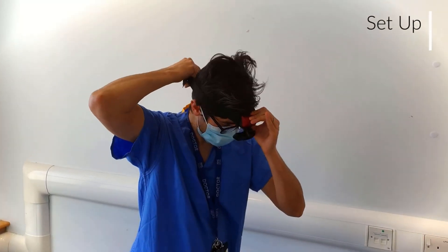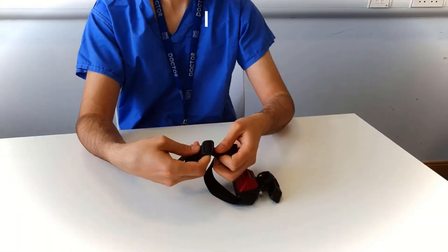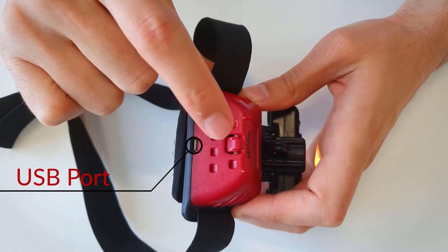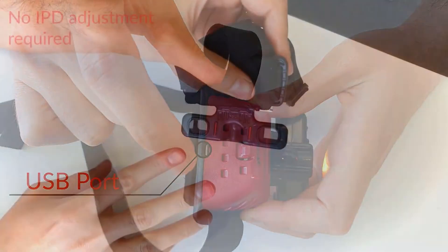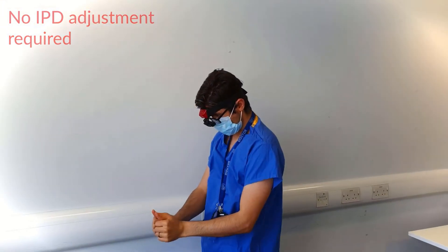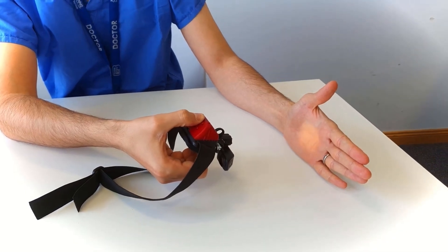Place the BIO on your head, making sure it's comfortable and secure so that it does not move when you're examining. You can see us adjusting it here. Turn the light on and check that the beam is aligned with your line of sight, so you're able to see your thumb singly at arm's length and it's in the centre of each eye's field of view. Adjust the brightness to suit the examination you're about to perform. In babies, it's best to start with the lowest illumination, then gradually increase until you can see enough detail without causing disturbance to the child.